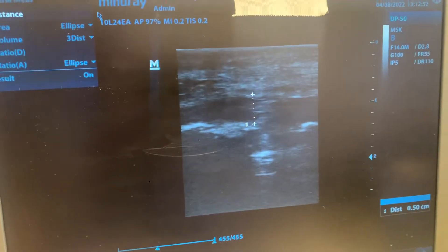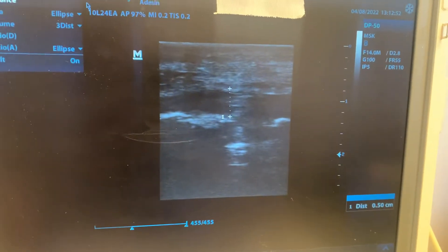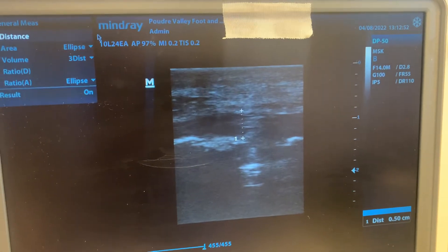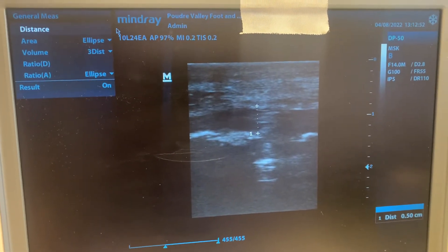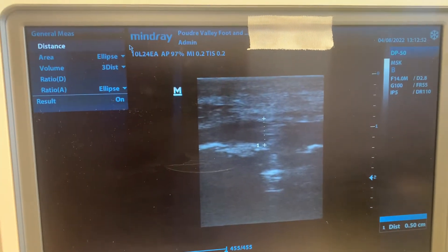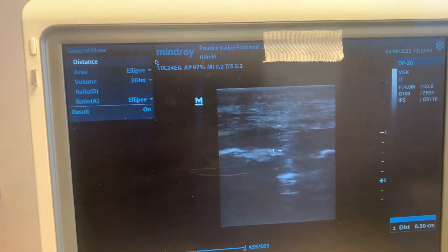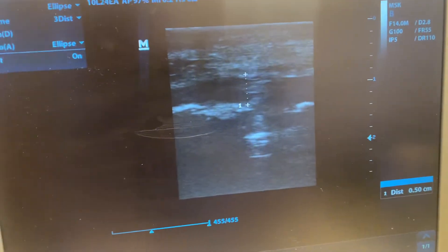This is to show you physically, from an ultrasound evaluation — this is objective data — to back up that this is a real deal, because he was at 8.9, very thickened, very degenerating tissue in his fascia, what we like to call plantar fasciosis — not plantar fasciitis, but rather plantar fasciosis, because studies have shown that the fascia is actually deteriorating.